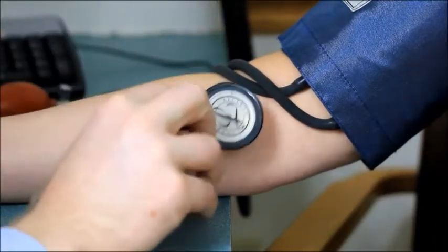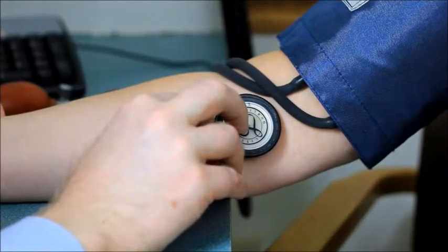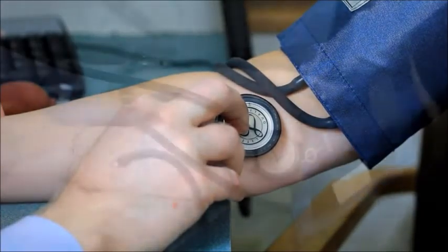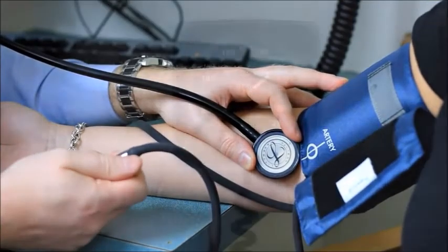Place the stethoscope lightly against the skin over the brachial artery, being sure that the pressure is appropriate for good sound transmission. Make sure that the blood pressure cuff and clothing do not touch the stethoscope.